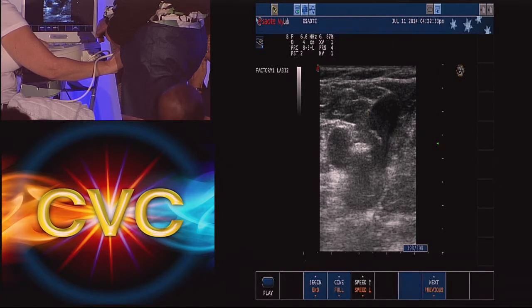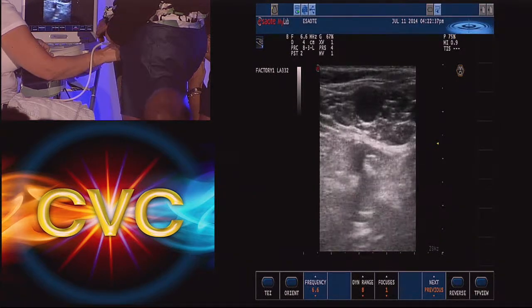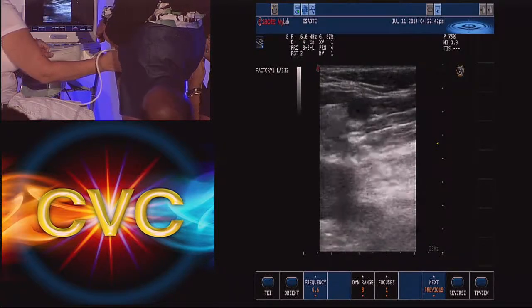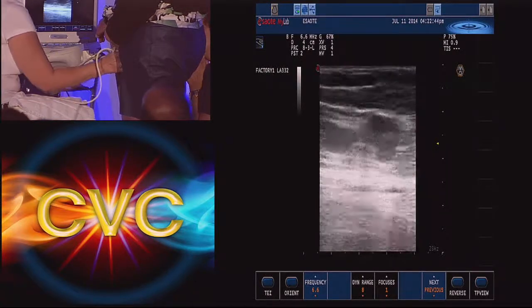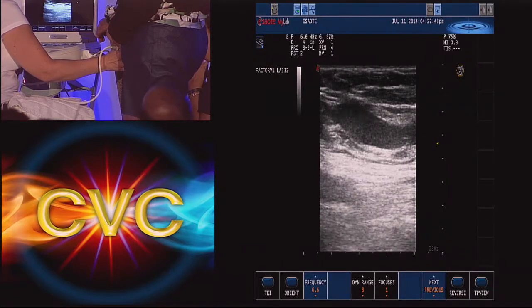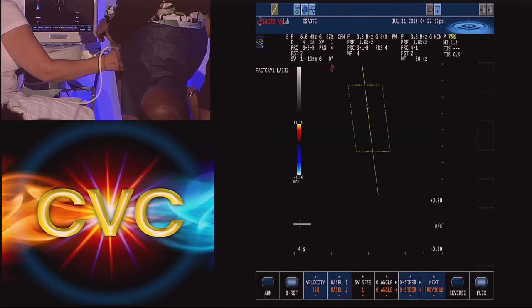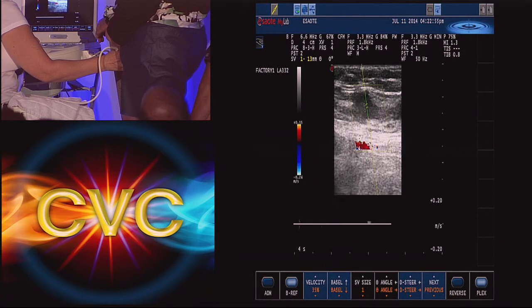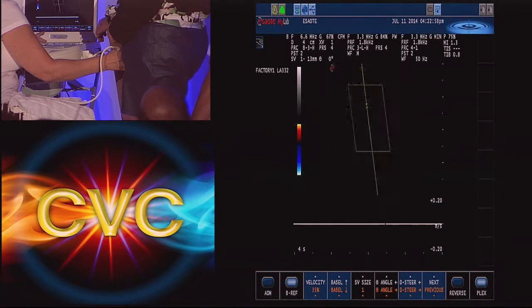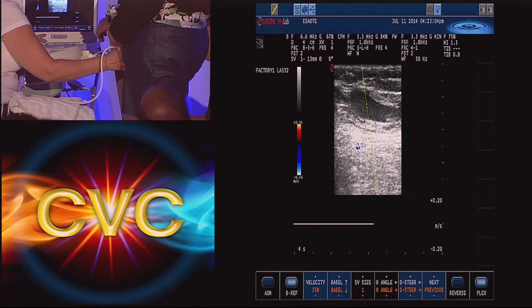It's about a centimeter right there. Yes, some insurances will require that, and they will not approve anything, like a perforator, less than 3.5. Now, you have somebody who's 250 pounds, a big guy, 6'7", just big by nature, he's going to have bigger vessels. You have a 92-pound woman with pain, that's when the problems come up with some of these guidelines.